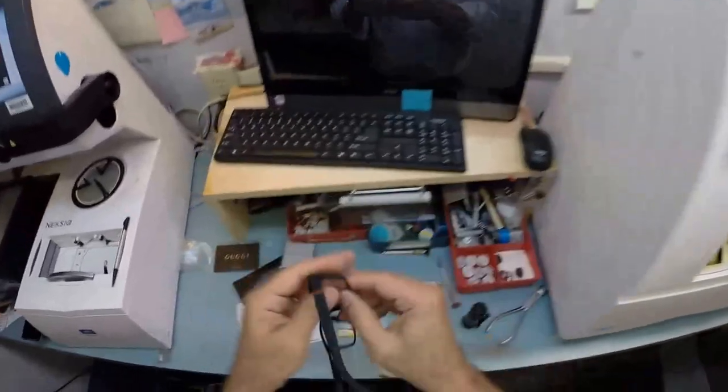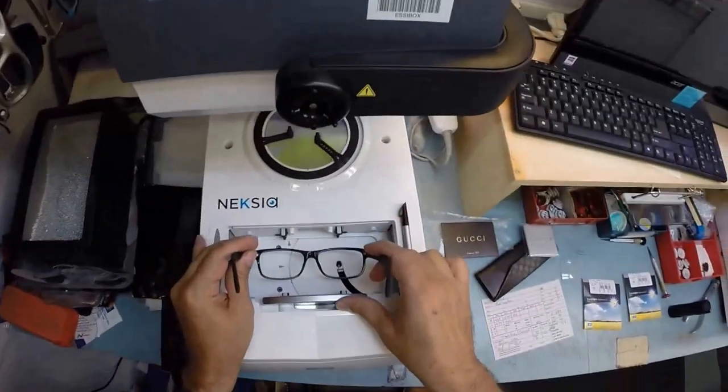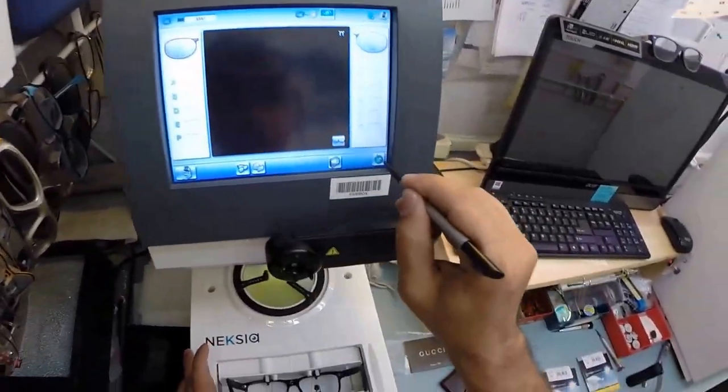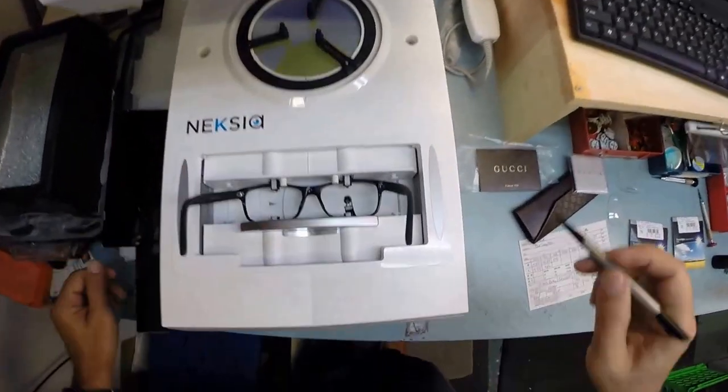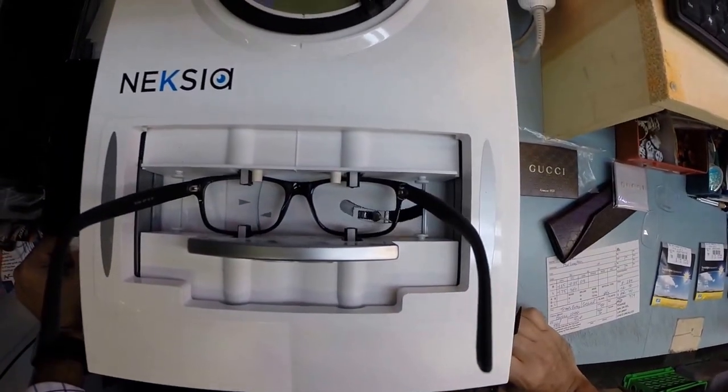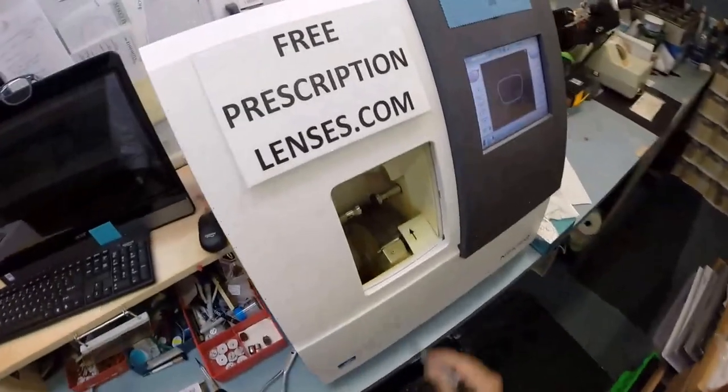For now I'm going to pop out the original demo lenses, one of which says Gucci. Let me go ahead and pop that out. I'm going to take your Italian frame and put it into the tracer element of my French edger and hopefully they won't start fighting. Hit the green button, the little stylus is going to pop up and trace the shape of the right side of the frame before moving over and doing the same thing on the left.